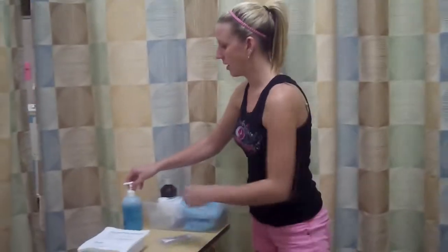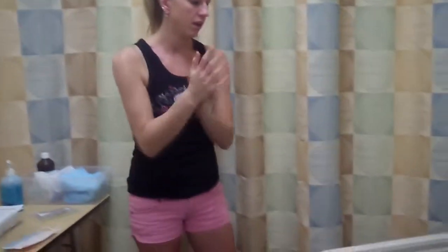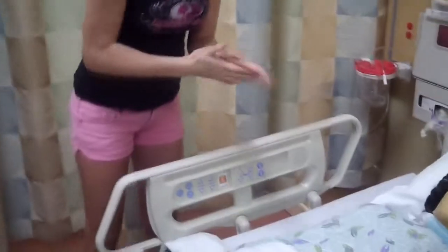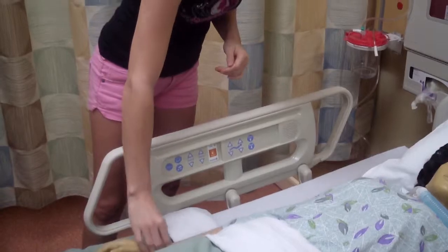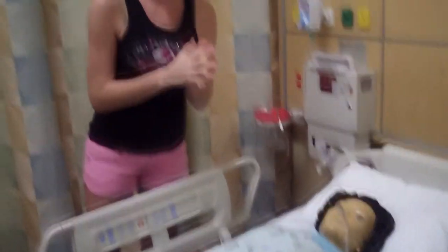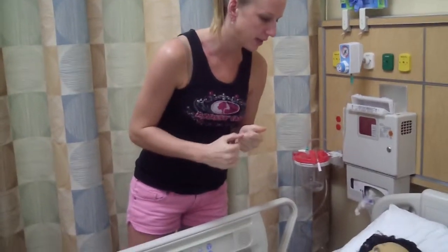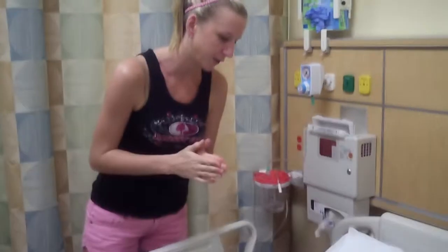So first thing, I would come into the patient's room, do hand hygiene, close the curtain for privacy, identify the patient. Hi, Miss Jones. Double check that it's her. Going to assess the need for trach care. And Miss Jones, you do need trach care today. Your dressing's a little soiled, so we're going to get that changed for you.